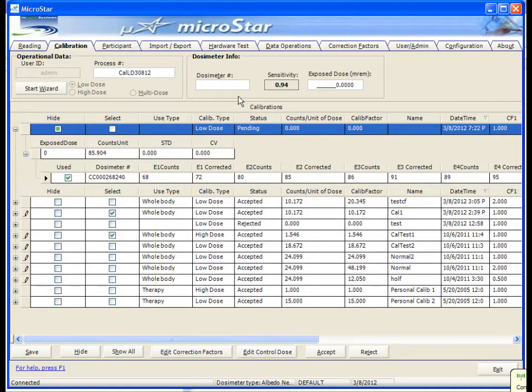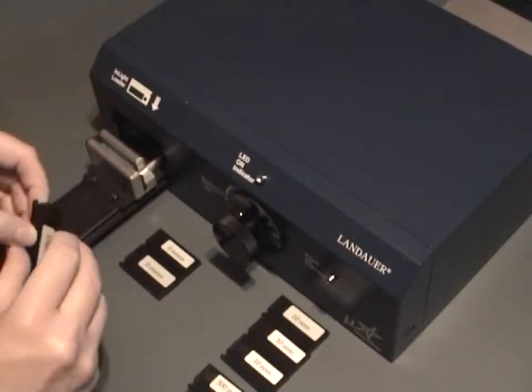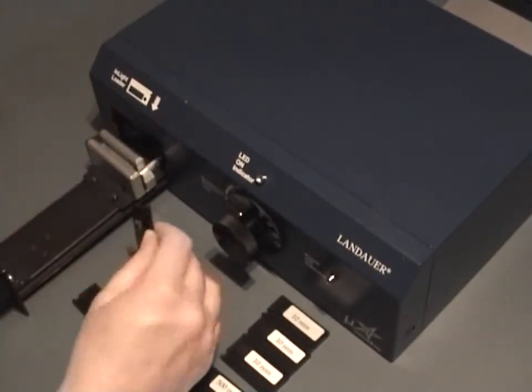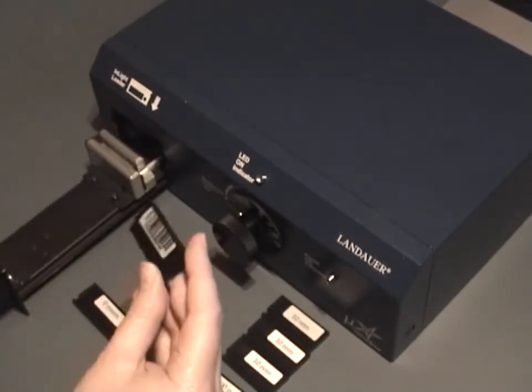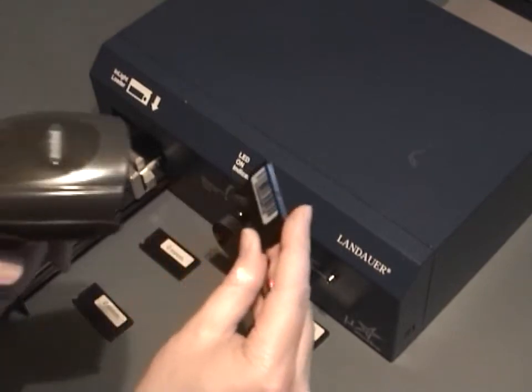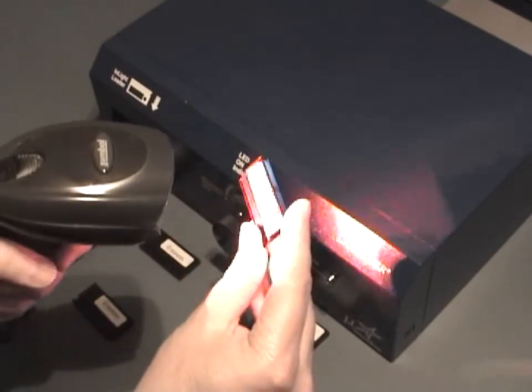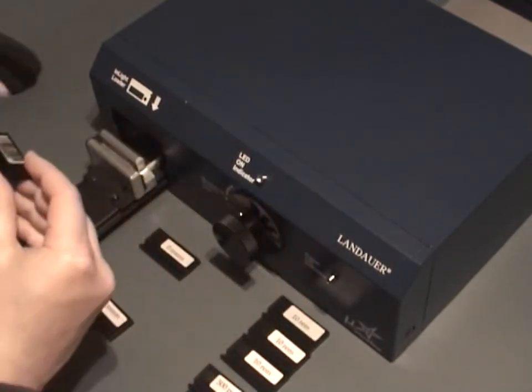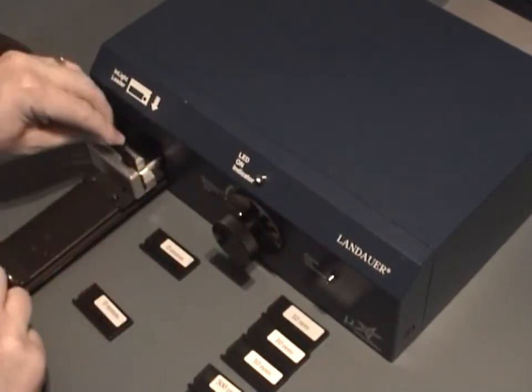Remove the first badge and scan the serial number of the second. Continue this process until you've read all three of the first dose badges.